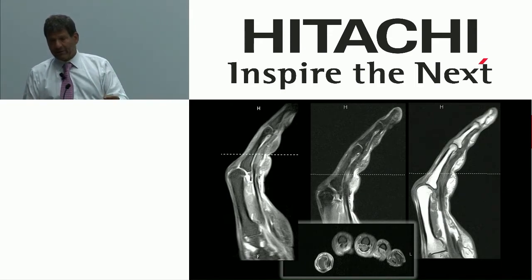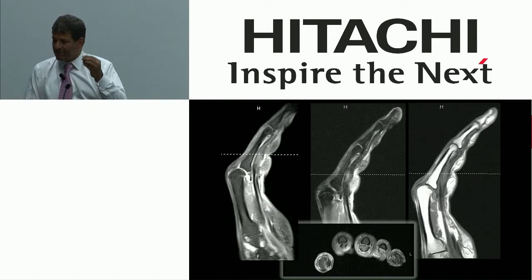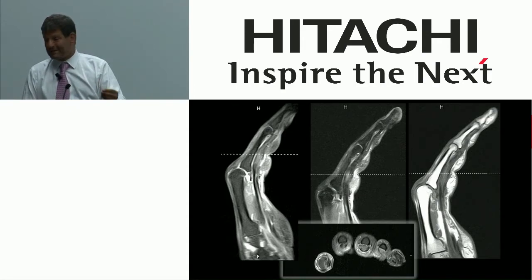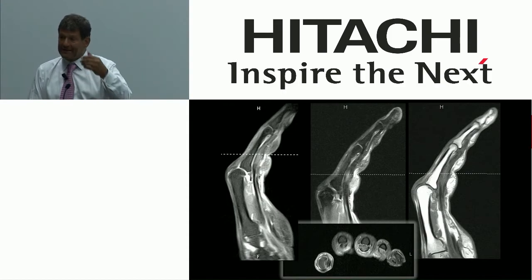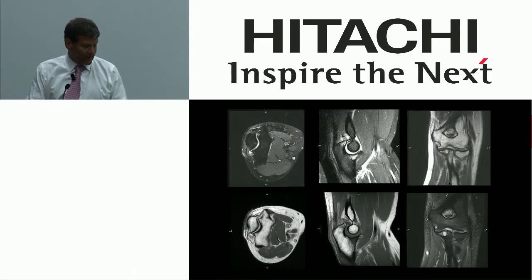When we used to work at 0.2T, we did very low spatial resolution, but we maintained our contrast resolution and our ability to make a diagnosis by getting the fat suppression properly done. Now, we did a lot of that with STIR because we didn't have these techniques on the open magnets. Now we can do the same techniques we can on all of our high field magnets, again adding to that consistency, reproducibility and standardization that I'm dying for.